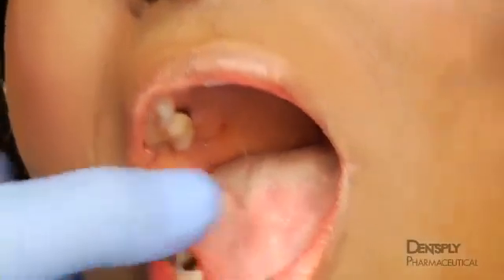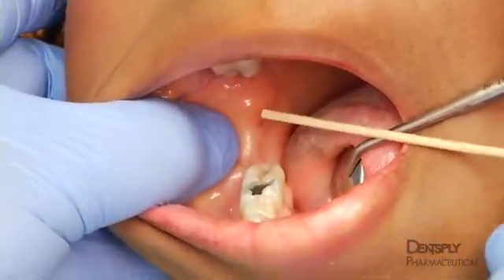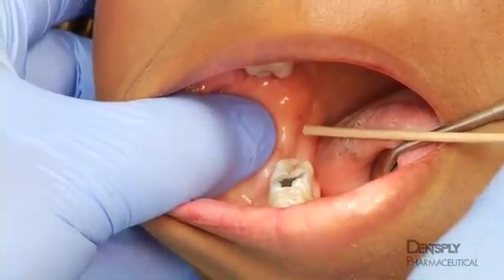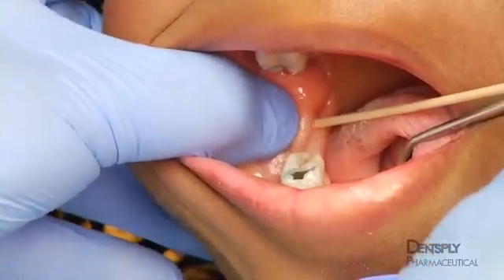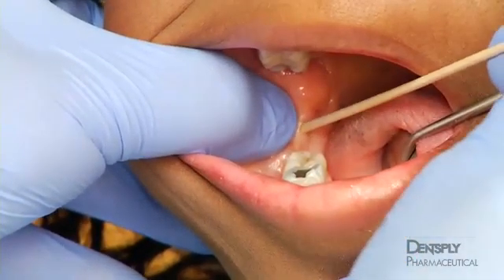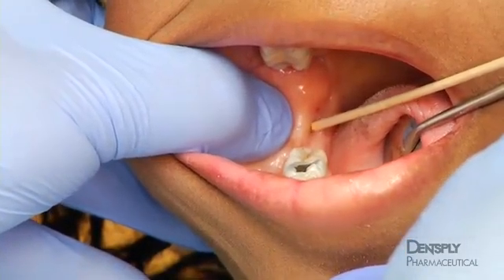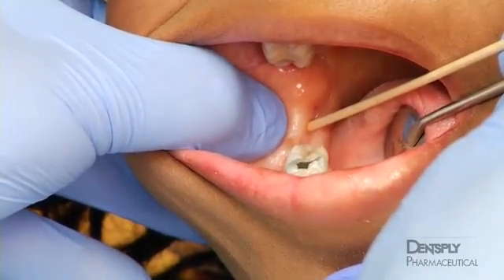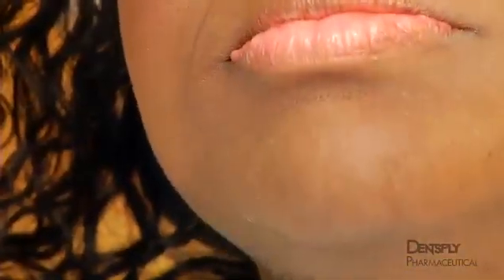Perhaps the most common cause for failure of the standard inferior alveolar nerve block is positioning the needle tip too far inferiorly. This can happen if the coronoid notch is not palpated correctly. For instance, if the thumb is too medial and palpates the temporal crest. Even if the notch is correctly identified, bisecting the thumbnail will misidentify the insertion point if the thumb is not parallel to the mandibular occlusal plane. These errors are more likely to occur in the patient who is missing posterior teeth.